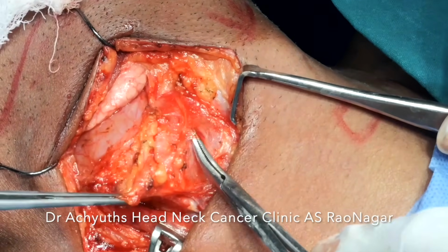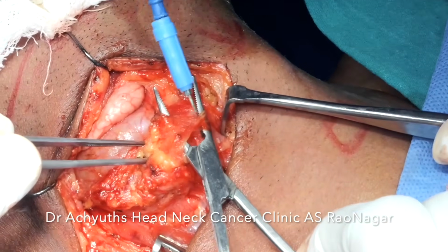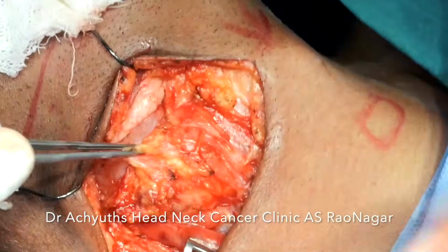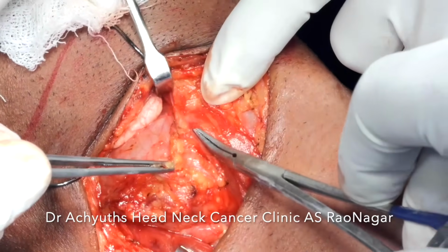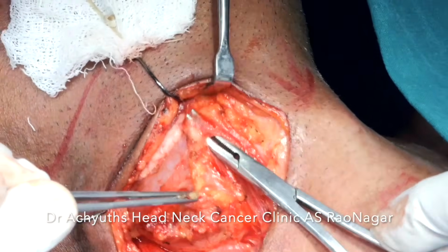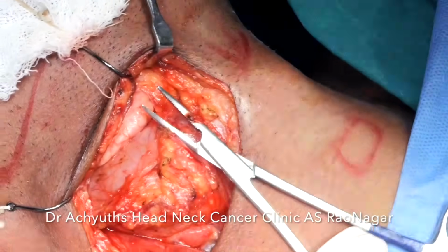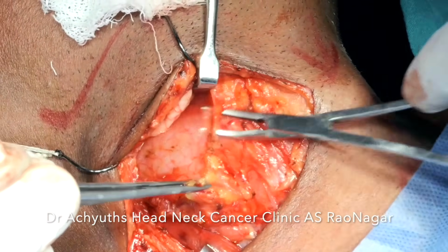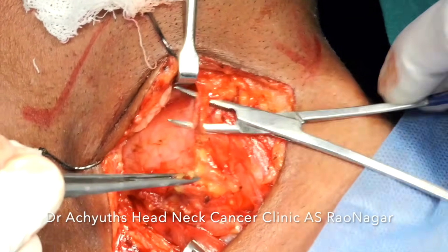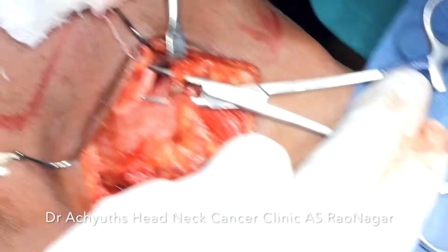Now here we can see that the strap muscles have come. This is the omohyoid muscle. Once we reflect the omohyoid muscle, then we will get the sternohyoid, sternothyroid and so on. In this way we are dividing the fascial attachments with the strap muscles also.